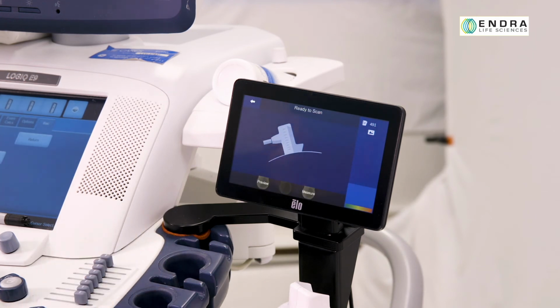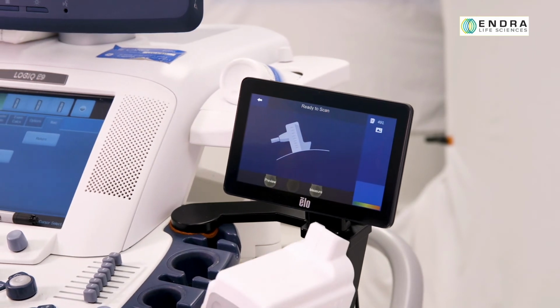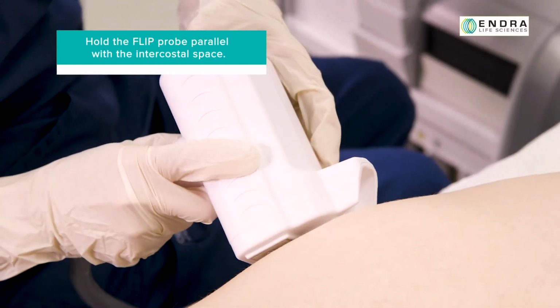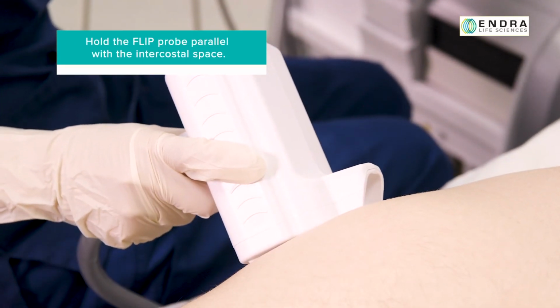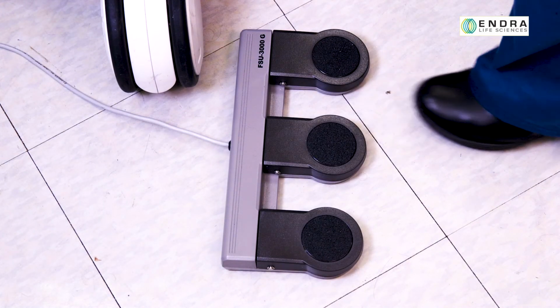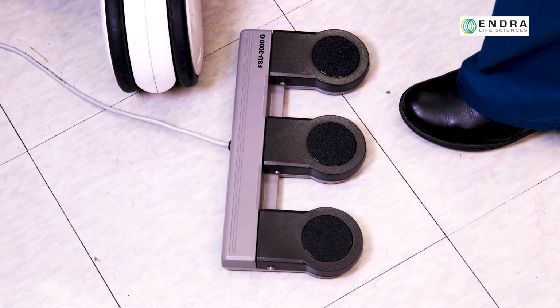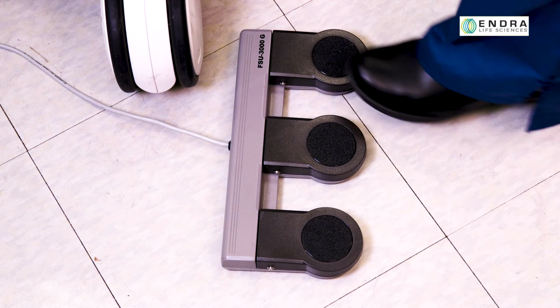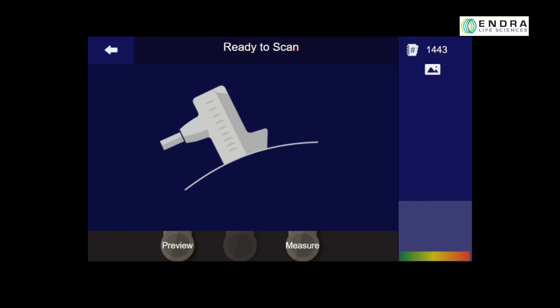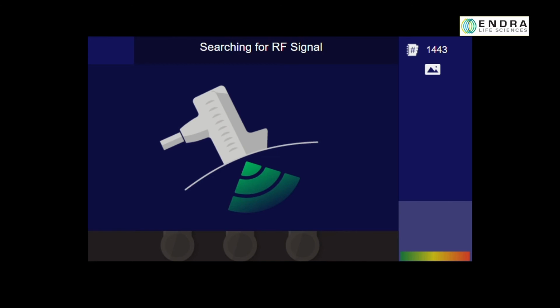When the Ready to Scan screen appears, remove the FLIP probe from its holder and place the ultrasound receiver in the same position that the ultrasound probe was in for the B-mode scan. TAEUS uses the same foot switches as the ultrasound system for hands-free operation while scanning. To make a measurement, press the right foot switch. If your ultrasound system is not equipped with foot switches, you can press the simulated Measure foot switch on the touchscreen display to initiate a measurement instead.